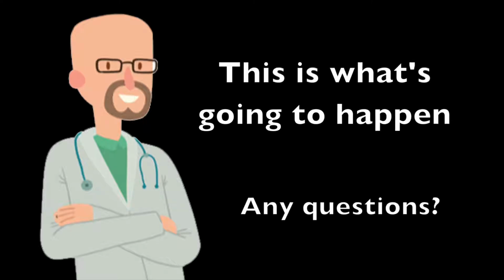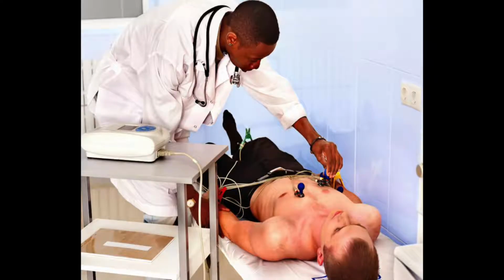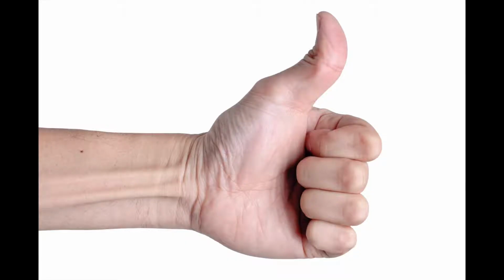The student will introduce him or herself and his or her role as a medical assistant. It is not essential for a clinical supervisor to be present for this non-invasive clinical procedure. The student will explain the EKG collection procedure to the patient and the steps involved. As part of the initial introduction, the student should confirm the patient or model's understanding of the procedure and elicit their verbal consent to proceed on the video.